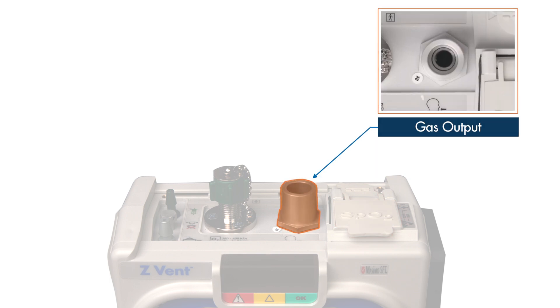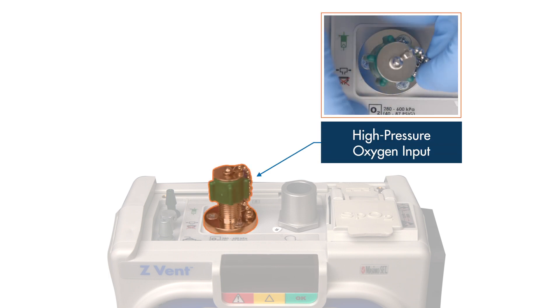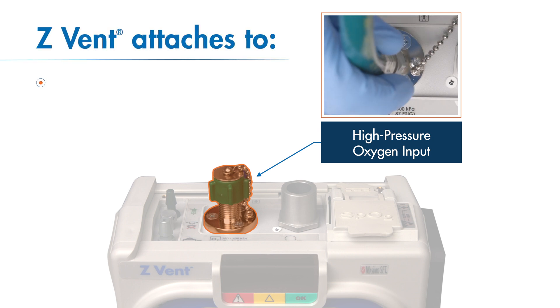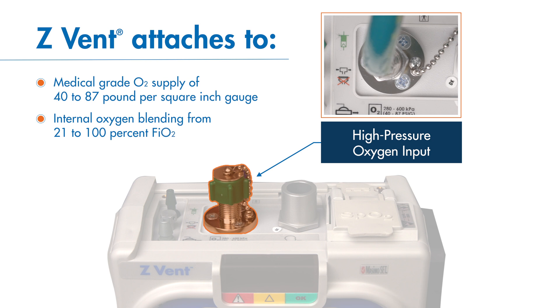In the middle, the silver cylindrical port is the primary gas output for the patient inspiratory circuit line. To the left, the threaded port with the green screw cap is the high pressure oxygen input. The Z-VENT can attach to a regulated medical grade O2 supply of 40 to 87 pounds per square inch gauge. This connection allows for internal oxygen blending from 21 to 100% FiO2.